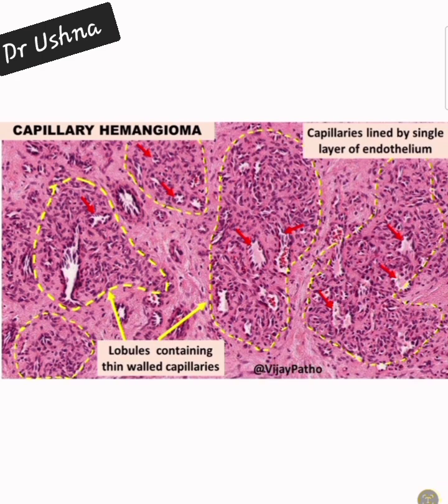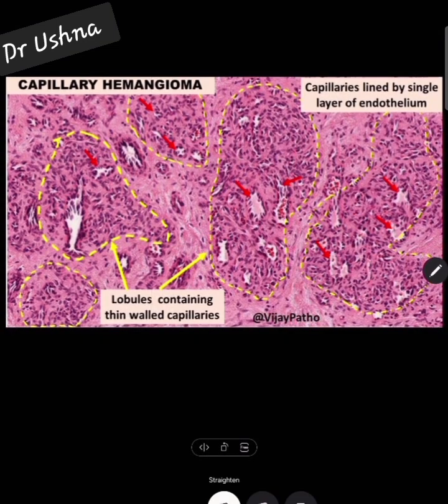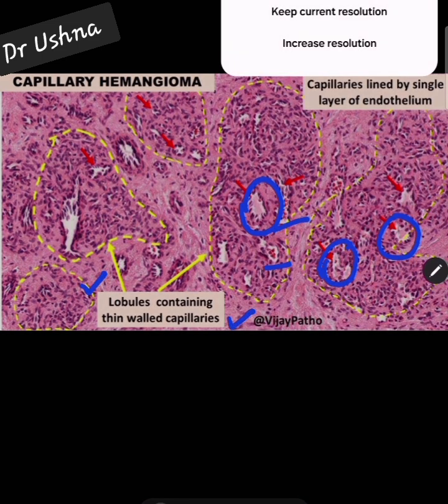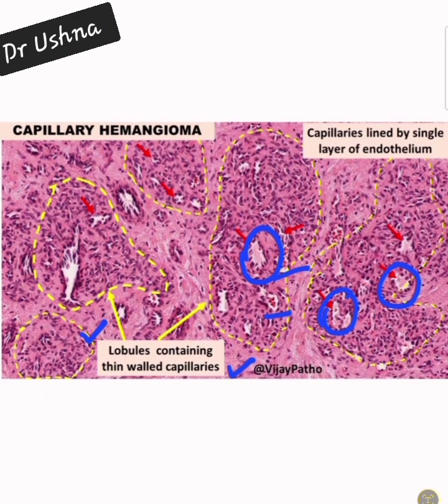This is your capillary hemangioma. Here you can appreciate different lobules — circulated lobular collections — where all the lobules are basically collections of small capillaries. The arrows are showing the small capillaries, and some of the capillaries contain blood. You can appreciate the blood collection here; these are small caliber capillaries lined by a single layer of endothelial cells.